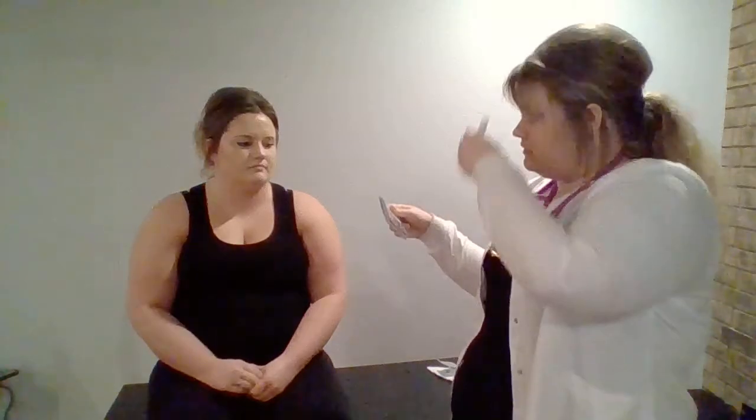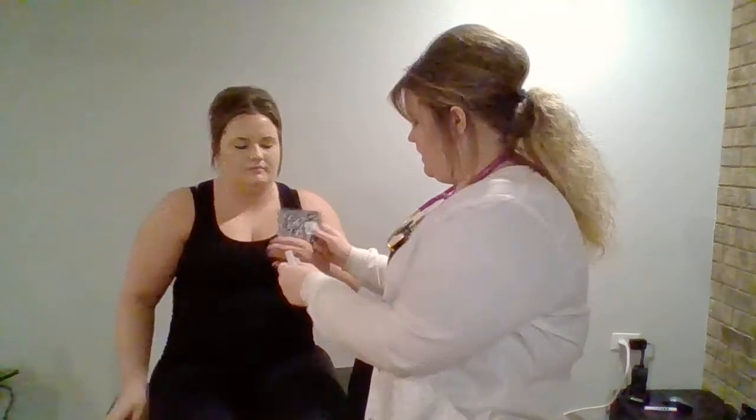First, I want to do the Snellen chart. I printed one off of the internet. She's going to use this little compact book to cover one eye. I'm going to tell you to cover one eye, and then I'll have you read the 8th line for me if you can. So we'll start with this eye if you'll hold it. Thank you. And then we've got it set up. 8th line. Okay. D, E, F, P, O, T, E, C. Okay. And now change to the next eye, and I'll read the same line. D, E, F, P, O, T, E, C. Okay, good. So we did the Snellen chart 20 feet away.